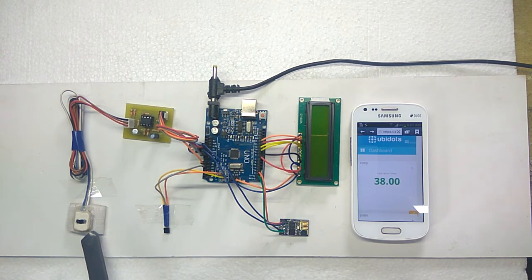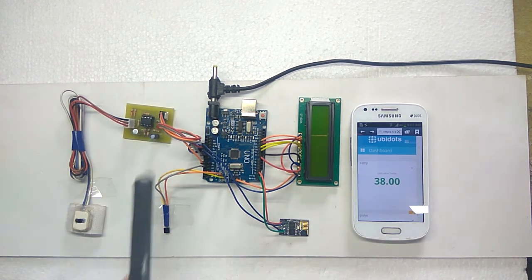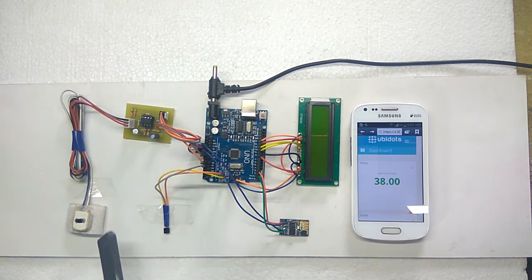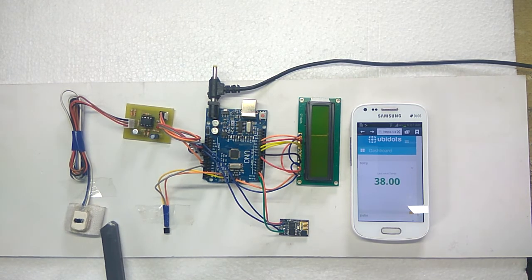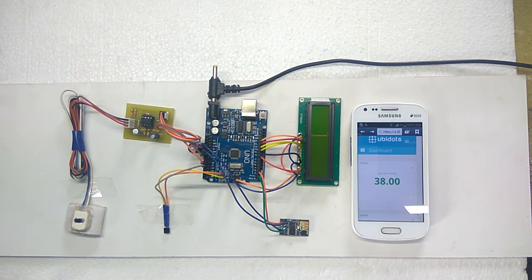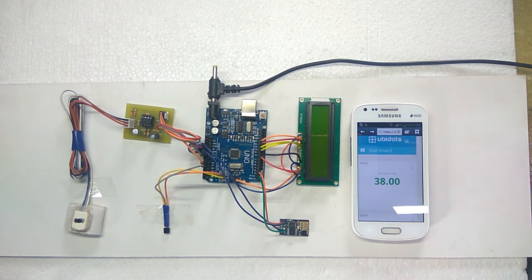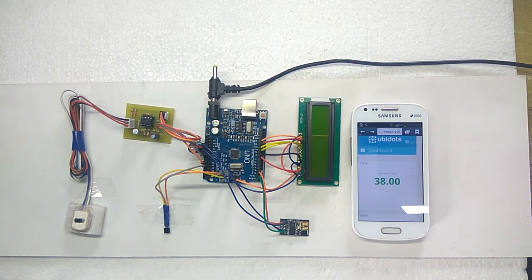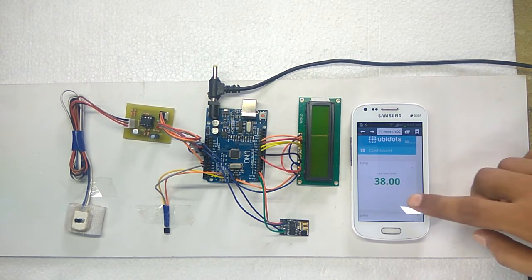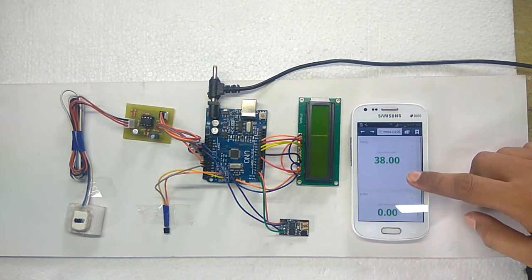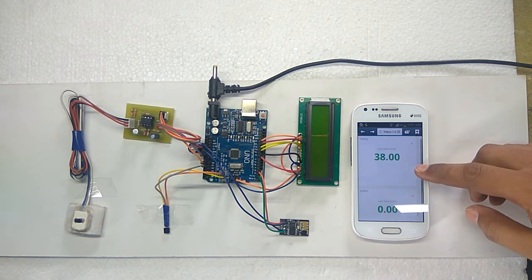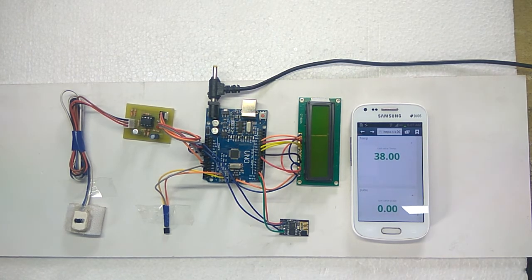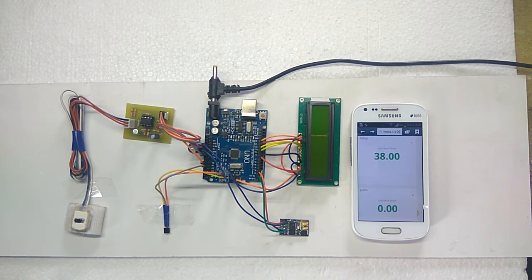Fingertip based heartbeat sensor. It is used to measure heart rate. Here we are using UBIDOTS as an IoT platform. We created two variables. One is temperature and other is pulse, i.e., heart rate.